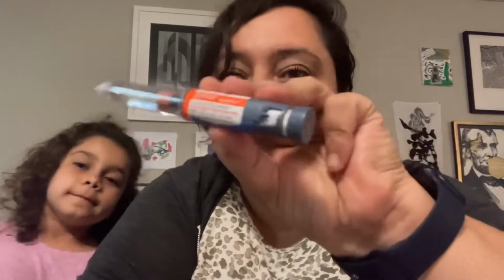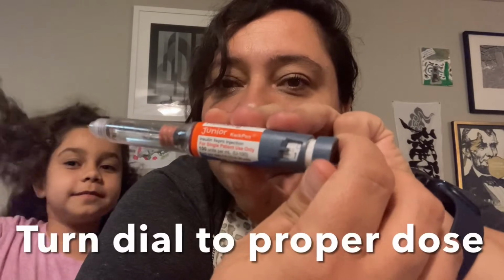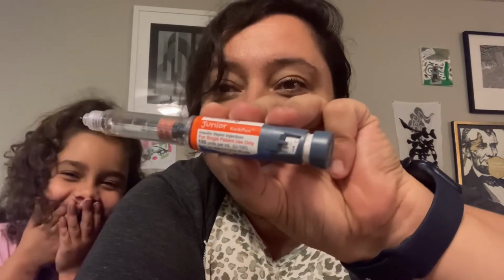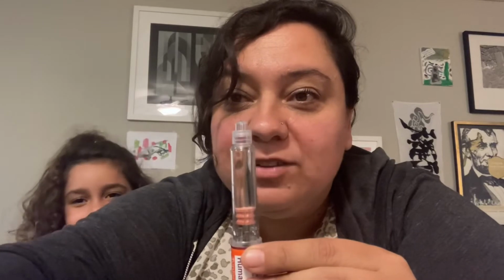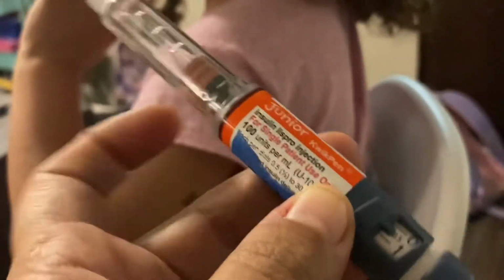Okay, so now we've primed the needle and we've made sure there are no air bubbles remaining. Now I need to make sure that I'm going to have my proper insulin dose. So I'm going to turn the dial to half a unit. You can see that it's between 0 and 1. All right, so now I'm going to pause the video so I can turn it around and show you giving the shot. Okay, so I have my needle. I've set it to 0.5, half a unit. And now I'm going to give the shot.